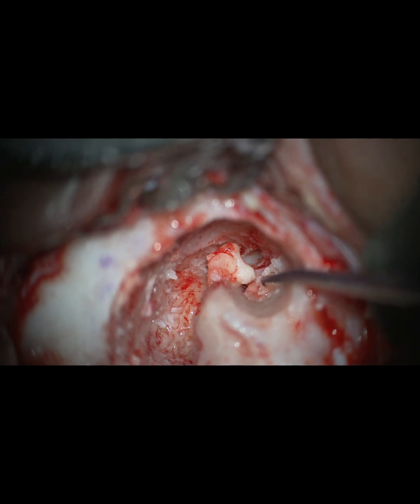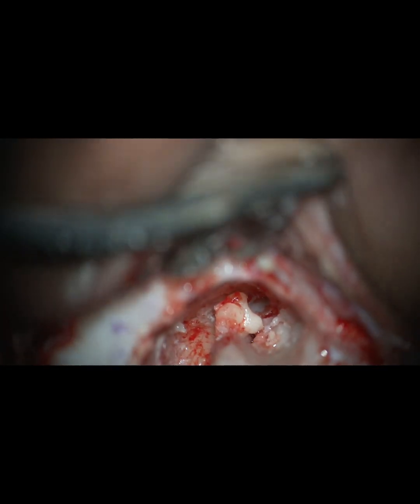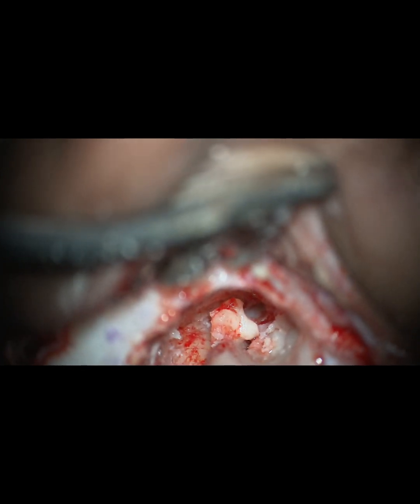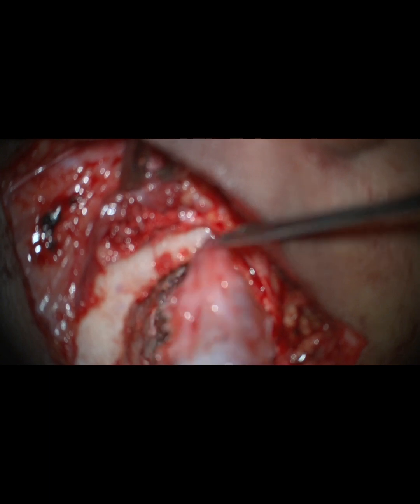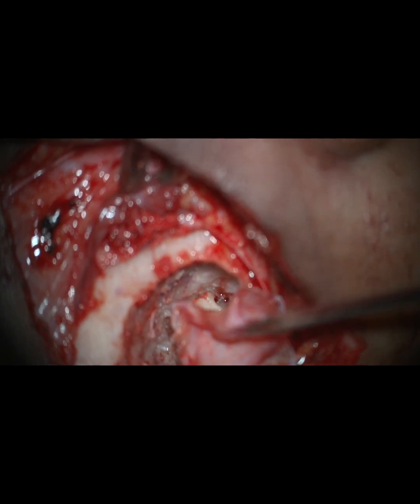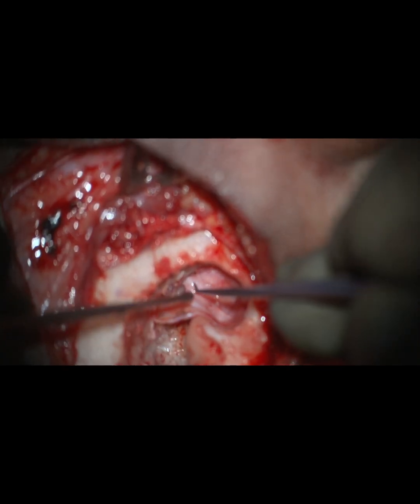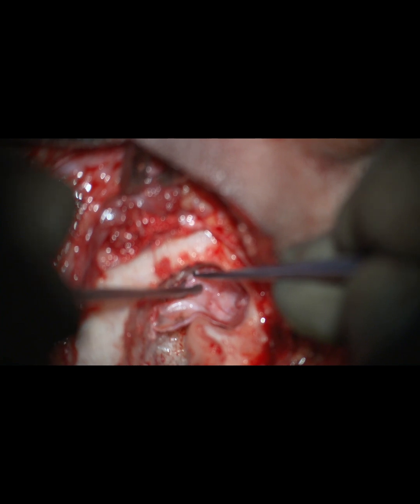You can use a bent pick also to remove small bone pieces and see how the ossicle chain is deformed or malformed. Temporalis fascia graft was harvested and placed overlapping all around the canal and in position with the ossicular chain.